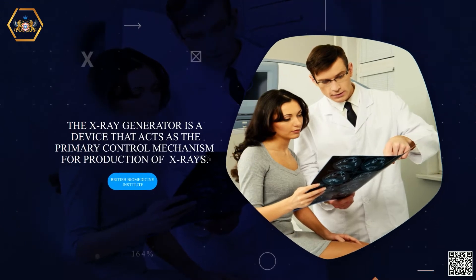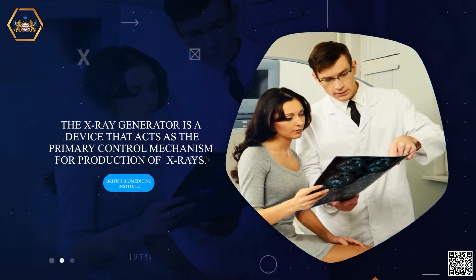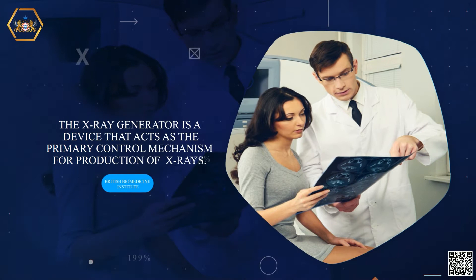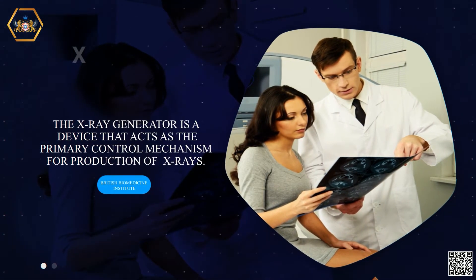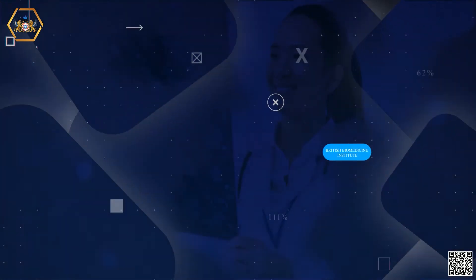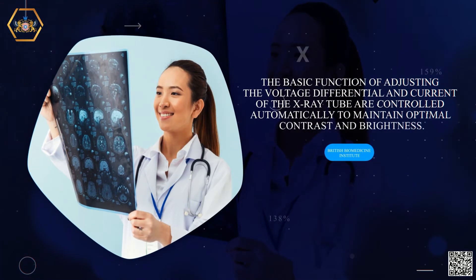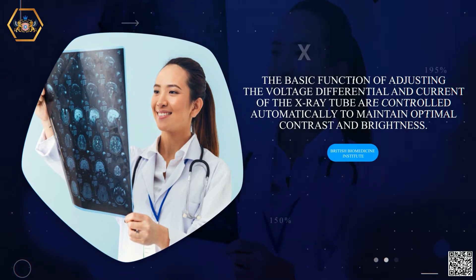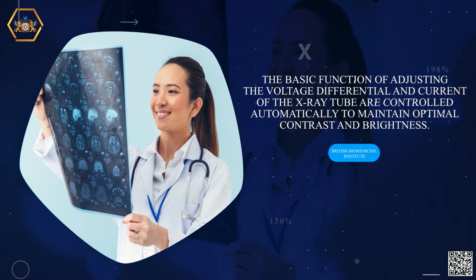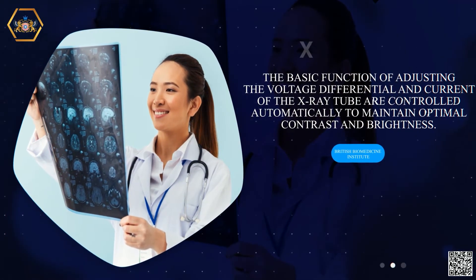The X-ray generator is a device that acts as the primary control mechanism for production of X-rays. The basic function of adjusting the voltage differential and current of the X-ray tube are controlled automatically to maintain optimal contrast and brightness.